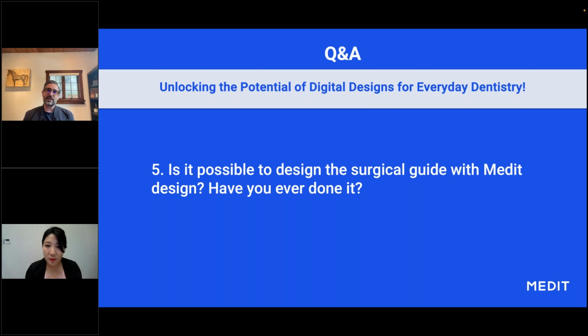At the moment, you'd be designing a surgical guide that doesn't necessarily have sleeves for the different implants, though that may be coming in the future. For now, you'd be designing a simple surgical guide that gives you the orientation and location, but without actually having the digitally planned implant there, and you can do it. It's a little bit more advanced, but I think there is discussion of streamlining that process in the upcoming upgrades and additions to the different apps. And I would expect that eventually it would be separated from Medit Design into its own workflow, or become part of the Splint workflow, or something like that.